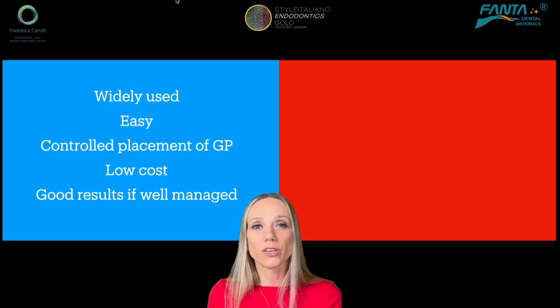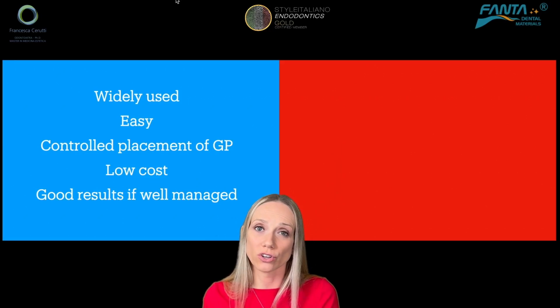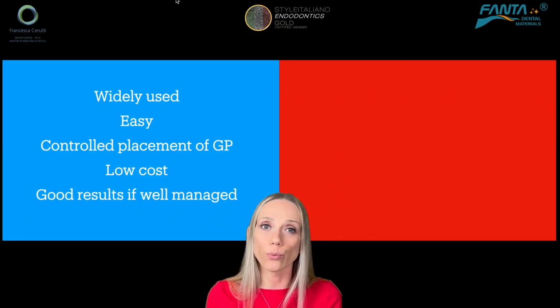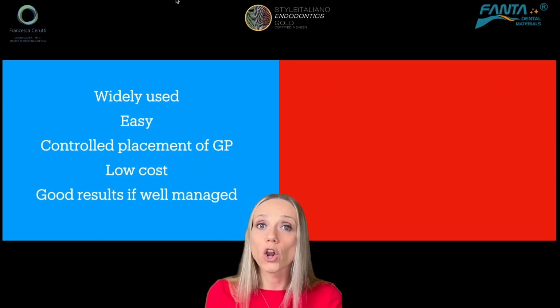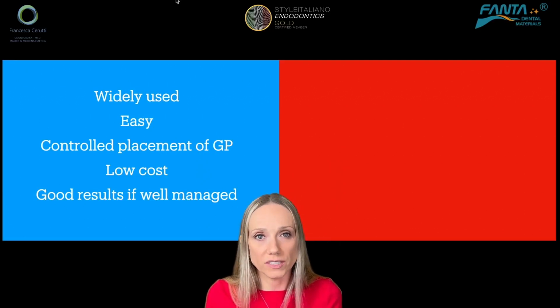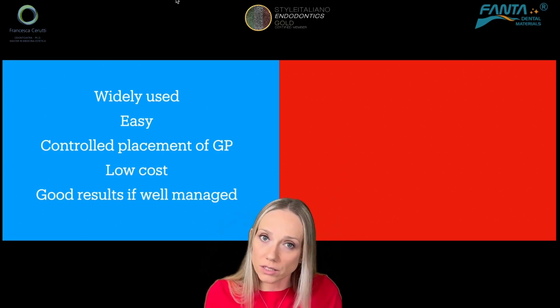Well, first of all, because they are kind of easy. There is a short learning curve, so almost everyone is going to be able to perform one of these techniques correctly with some training. And also, they are low cost because we don't need to buy several devices in order to be able to perform this kind of therapy. And if we manage them well, they can give good results.